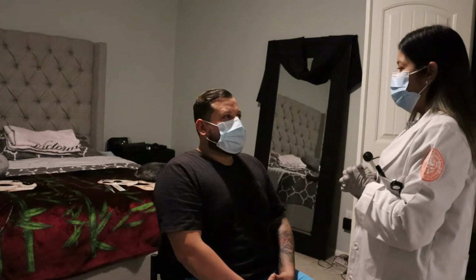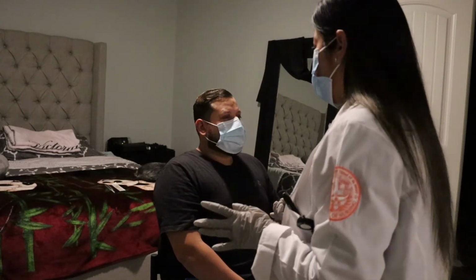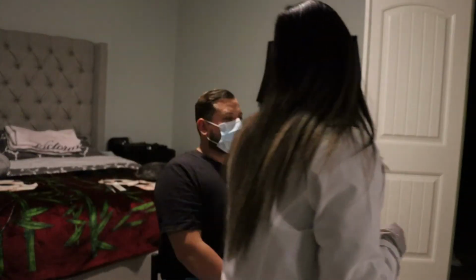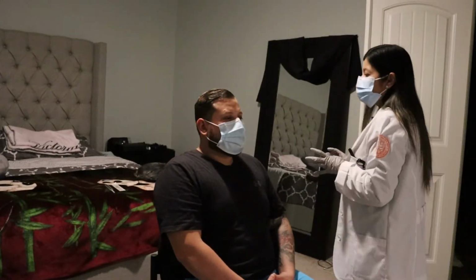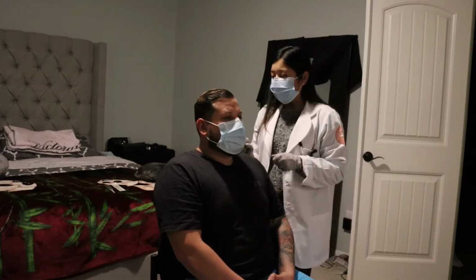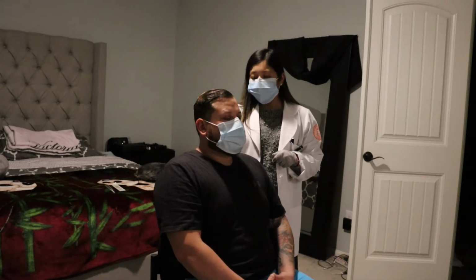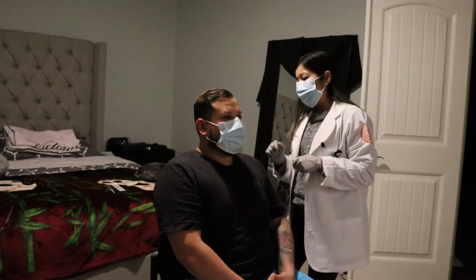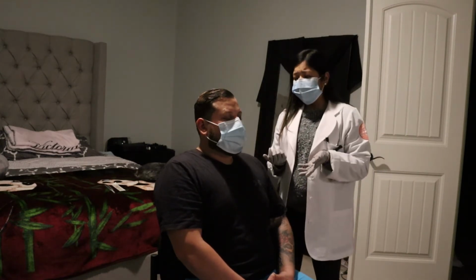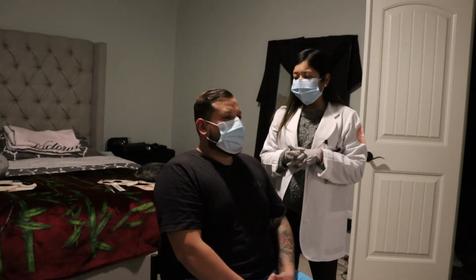Okay. And after that, then I would assess your ears. So I'm just going to look at the external part of your ears. The ears are symmetrical. There's no scars, no lesions noted. Then I would pull the auricle up, back, and out, and I would use an otoscope to assess the ear canal and the tympanic membrane. And the tympanic membrane should be a pearly gray color.